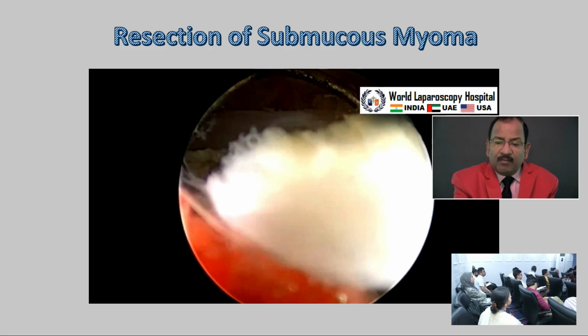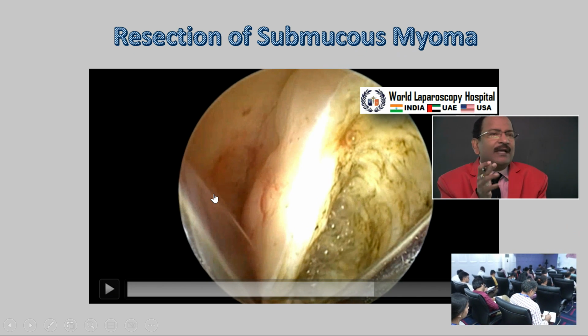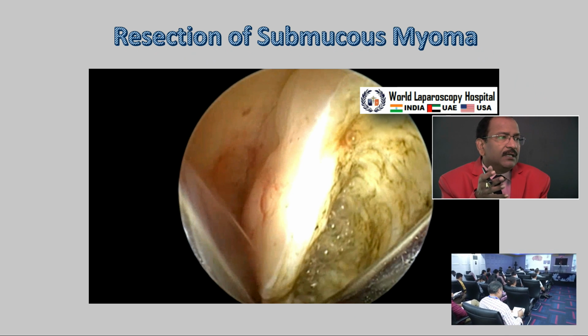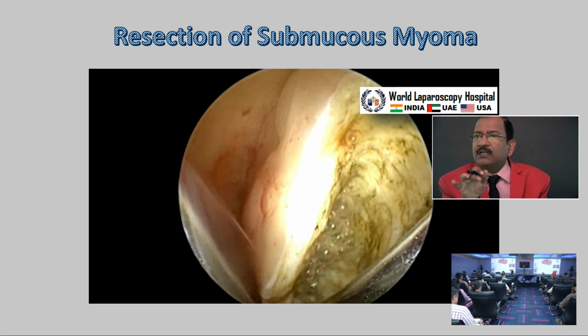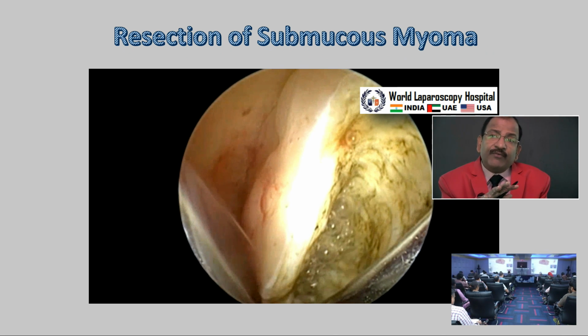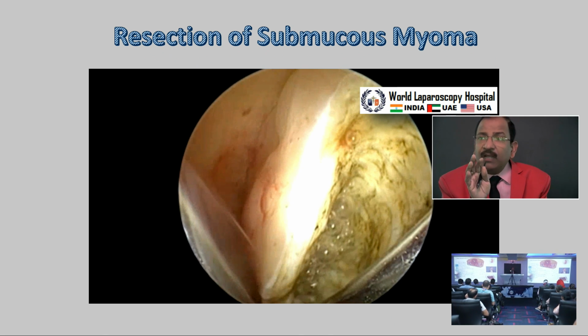Remember, if you are buying a simple electrosurgical generator, simple means only 1 lakh rupees, like Eclipse or Jahangir, the cheaper Indian ones, they have two types. One is 250 watt and one is 400 watt. For laparoscopy 250 watt is sufficient, because we need maximum 70-80 watt. But if you want underwater, then you have to buy a 400 watt generator.